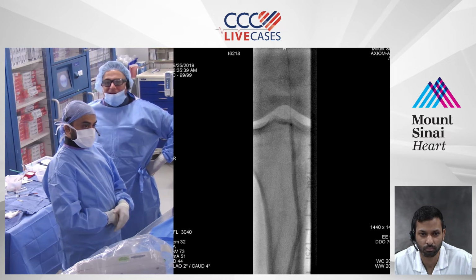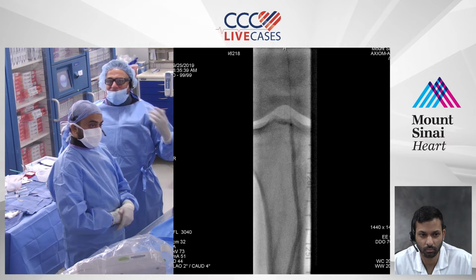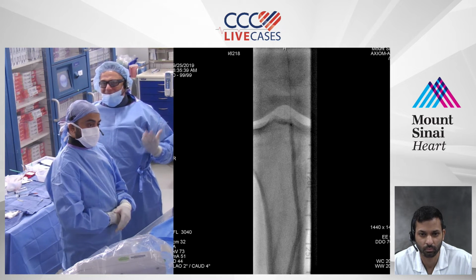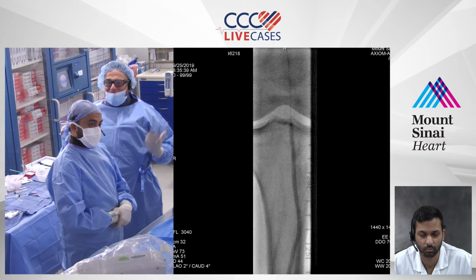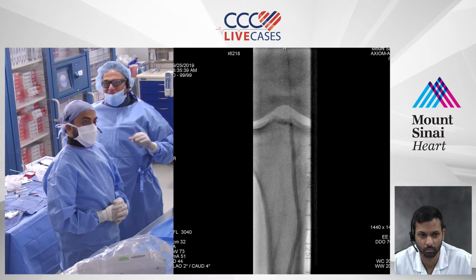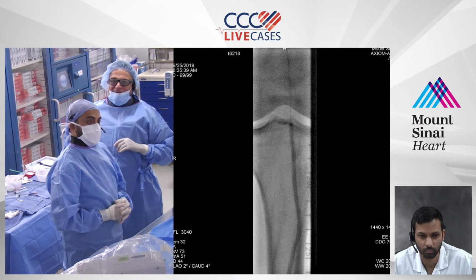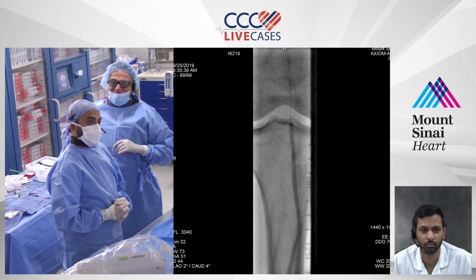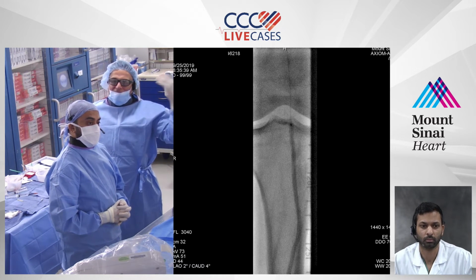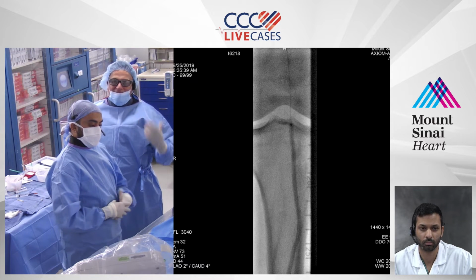So my goal is not to stent this pop, because I believe that stenting the pop, although it's an occluded vessel, you would have never bypassed to it. I just think it creates a conundrum of problems later on that we have to deal with. So it would be nice if I could just balloon the tibial, have no dissections, maybe plus minus atherectomy. We'll talk a little bit about that. And then maybe drug-coated balloon the pop with a 4 or 5-0 after IVUSing it. So I look at my goals of what my end game is after I've crossed, and then tailor my therapy to that.